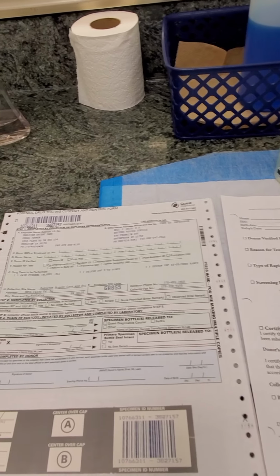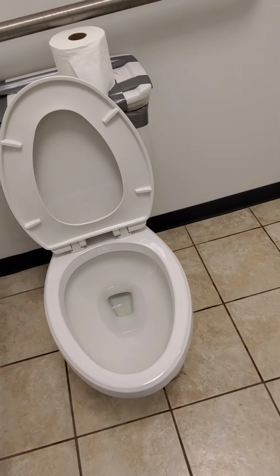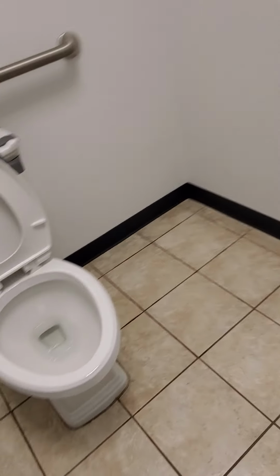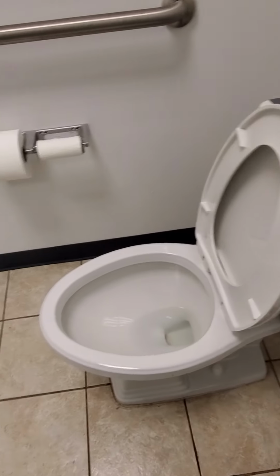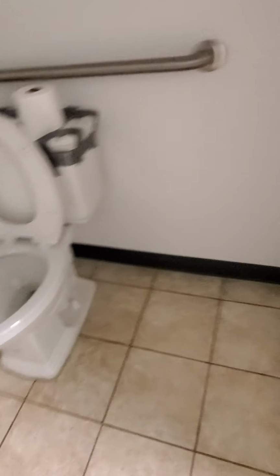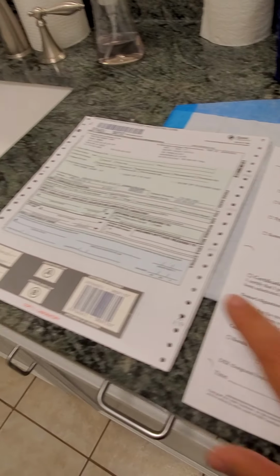But yes, that is the proper way to collect the specimen. Once you're done filling out everything, the last step is to make sure you come in here before the patient leaves. Make sure there's nothing in the toilet. Make sure that they didn't leave anything behind. And when I say anything, that could be a condom, that could be a container that they used to bring in the specimen. You just want to come in and make sure that the restroom is okay. And then you can flush the toilet. And make sure you give the patient a copy.